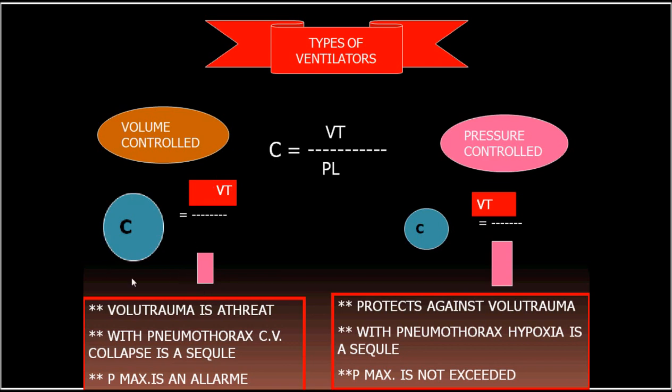Say if the compliance is 50 ml per centimeter water and the tidal volume is 500, the pressure will be 10 centimeter water.